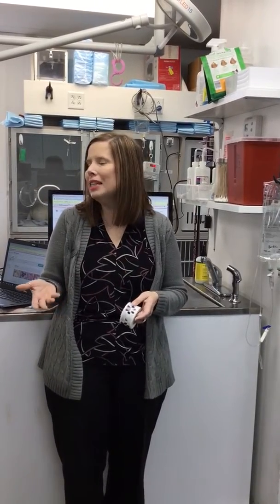So what'll happen is, if you were to look at a sample and you've got the plasma and it looks like just frank blood in the bottom, I would not trust those results. It's a misconception. Yes, you put whole blood in there, but it spins it down and it runs the plasma. So in that aspect, more is not better. I was that girl. I was like, oh, I got a bunch. Let me put all this in there.